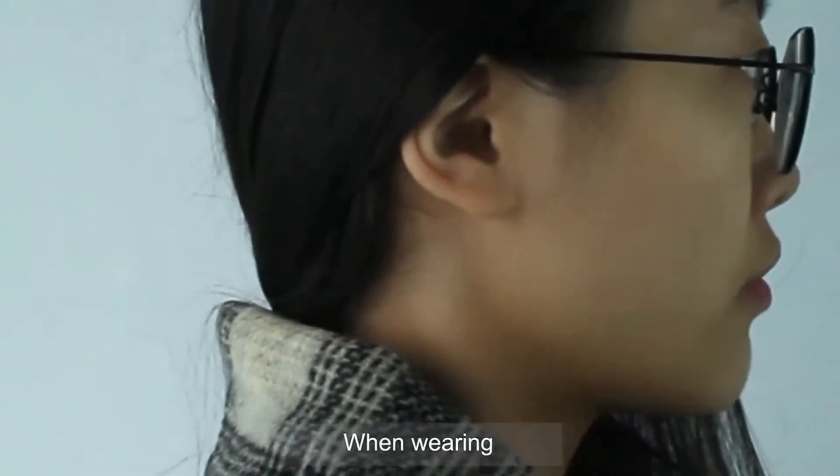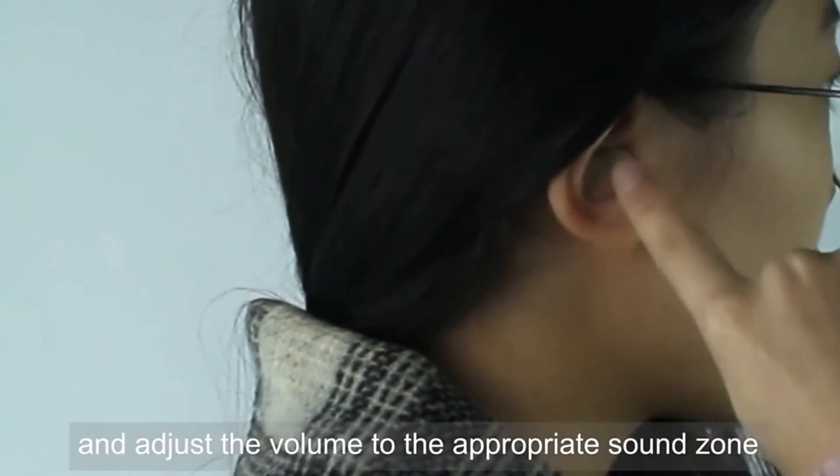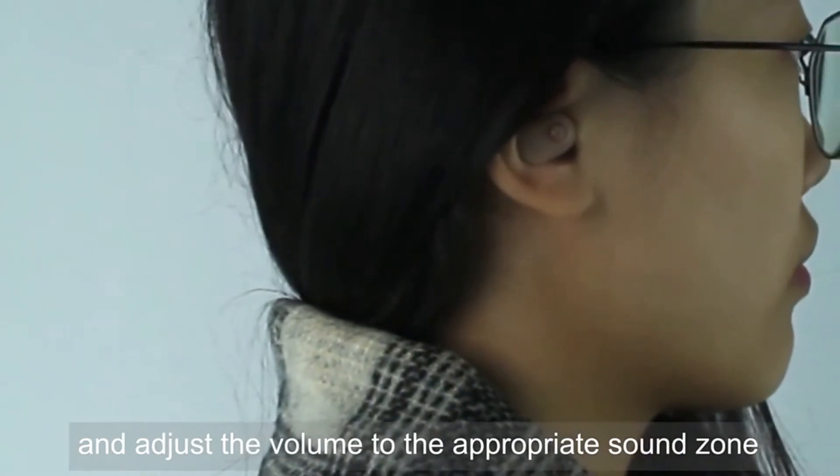When wearing, put the hearing aid into the ear gently, adjust it to a comfortable position, and adjust the volume to the appropriate sound zone.